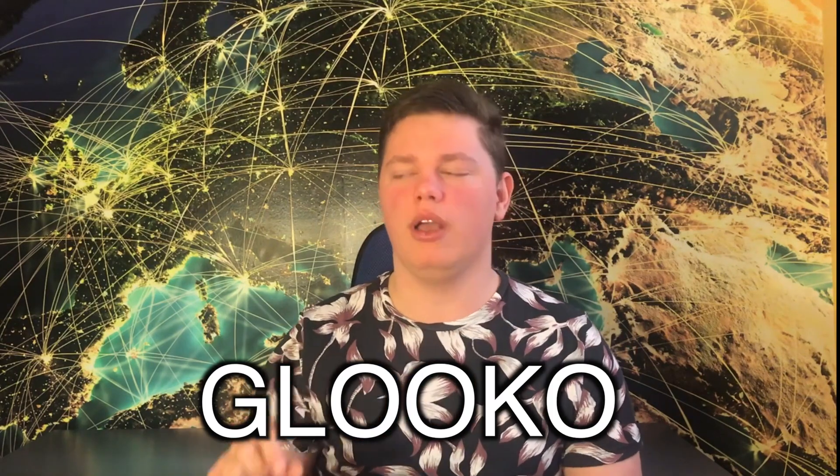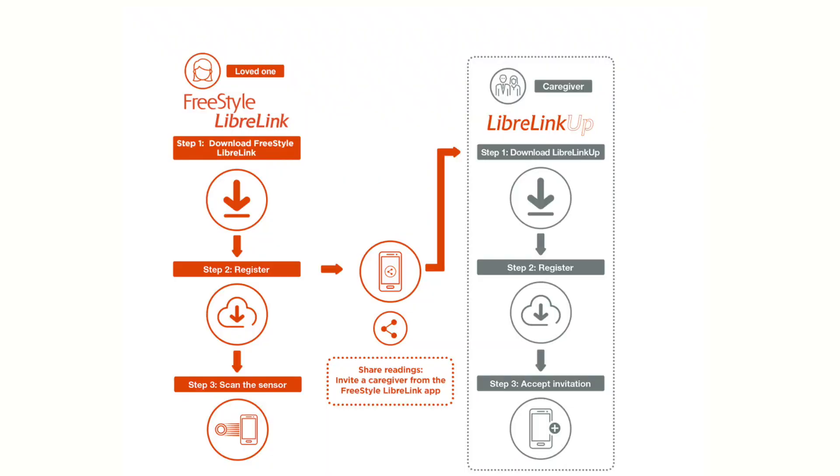Diasend in America is called Glooko. You are also able to send your readings to a sharing platform called Libre Link Up. If you have someone who would like to get your readings when you scan your Freestyle Libre sensor, they can install the Libre Link Up app on their iPhone or Android device, and every time you scan, your readings automatically send to their phone. It's similar to Dexcom Share — the difference is you need to manually scan your Libre first, and then the reading is sent to your partner, mum, dad, or whoever you want to share with.